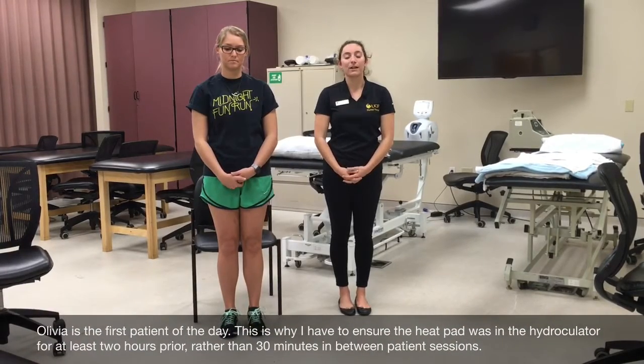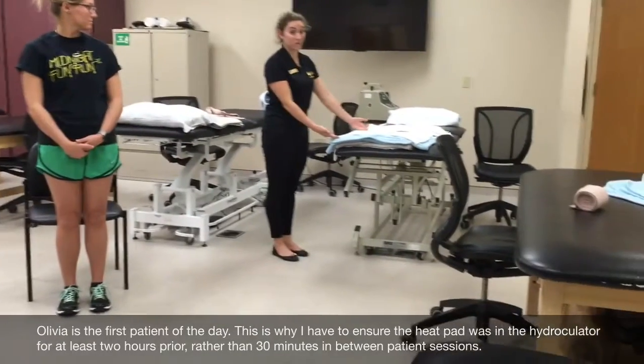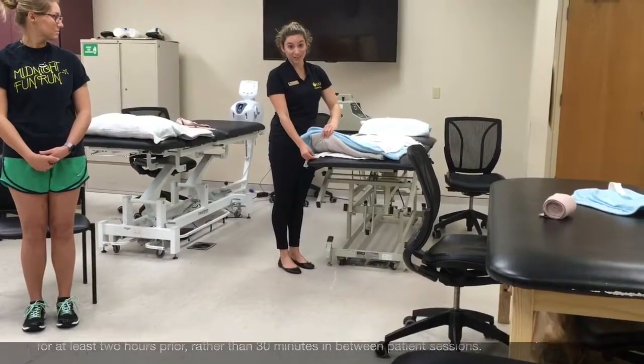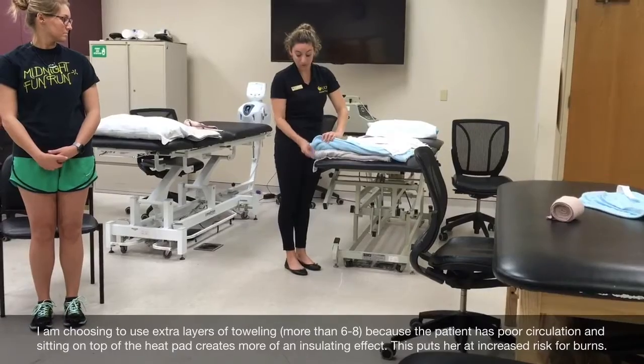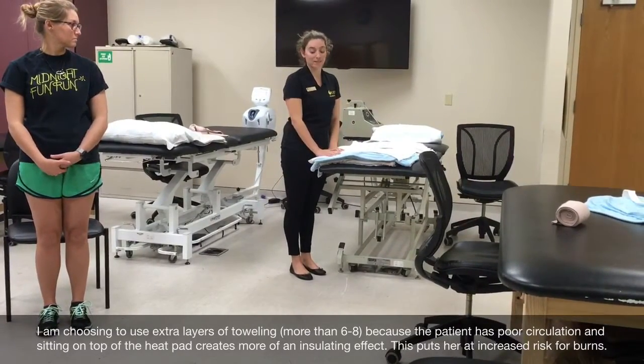Before I position her, I'm going to heat the pack in a hydrocolator with water temperature between 158 and 167 degrees Fahrenheit for at least two hours. I will then wrap the heat pack in toweling. I will place an insulation layer of towel between the chair and the heat pack, then two layers, four layers, two layers, and one layer for a total of nine layers of towel.